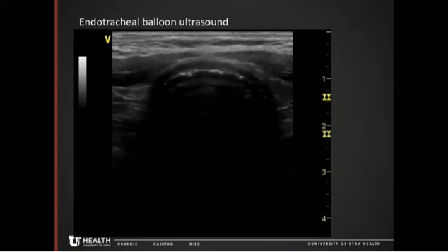And what that shows is that, in fact, when you intubate a patient and inflate the cuff in their trachea, the trachea actually expands in the region of the cuff. And so if the cuff is high enough, if it's above essentially the sternal notch, which would be desirable, that confirms that A, your cuff and therefore your tube are present in the trachea. So this is useful as a way to rule out esophageal intubation for new intubators. And then also the presence of the cuff above the sternal notch also indicates that there is not a main stem intubation.